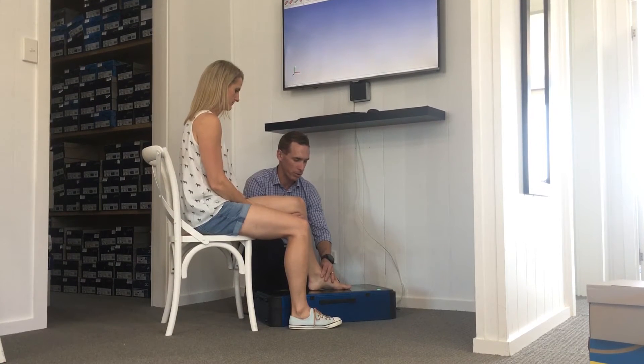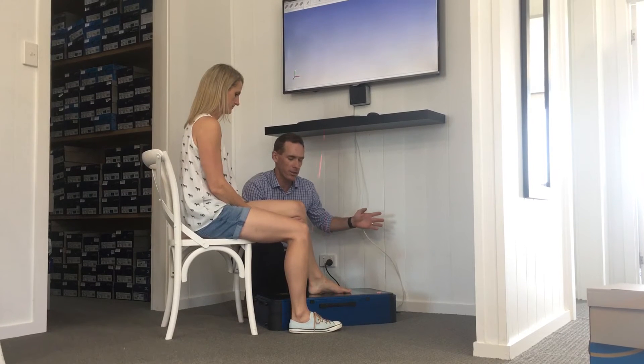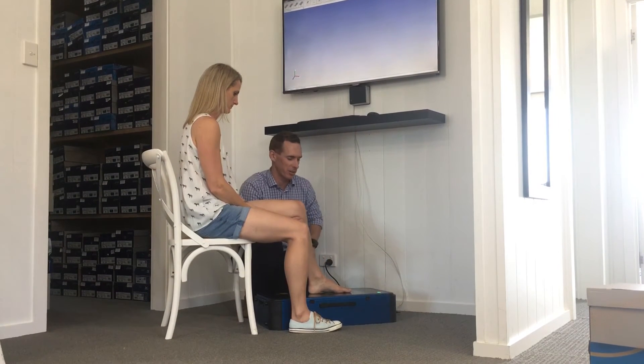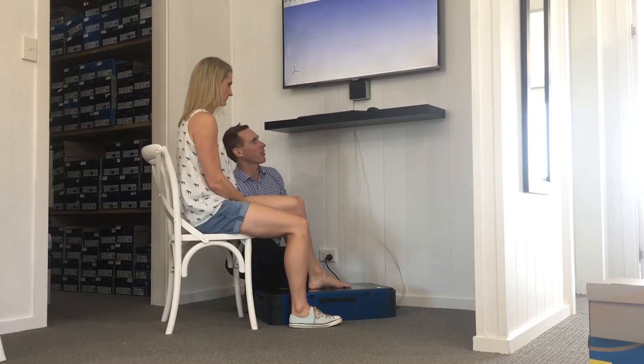We position the foot in the exact position that we'd like it to be in, so we're capturing exactly what we want. The red line scanning the foot is hundreds of little laser beams all very closely together — 0.2 of a millimetre apart. They shoot up, bounce off the foot, and those lasers measure that distance really accurately.